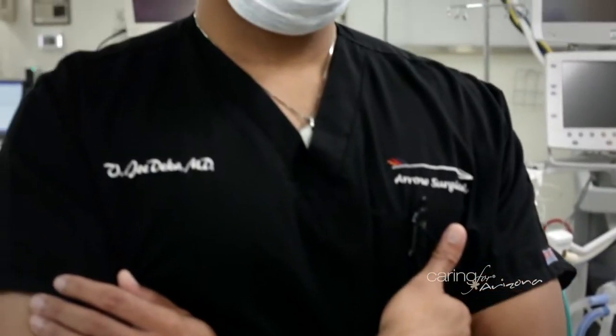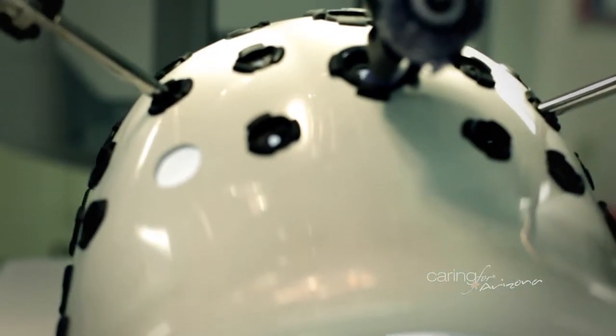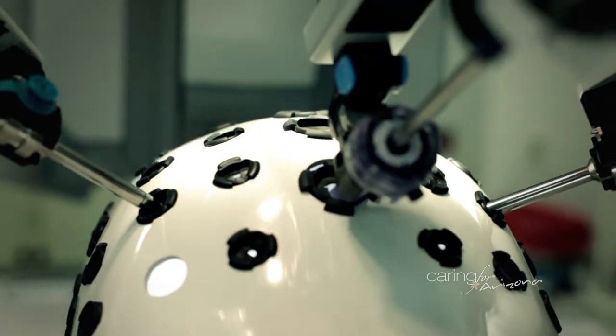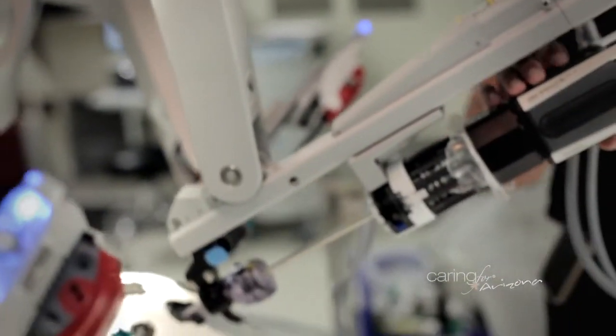The reason people recover a little faster from laparoscopic or robotic surgery is the incisions are smaller, so they might have less pain. They can get back to doing their normal day-to-day things a little quicker. Not every surgeon feels comfortable with robotic or even laparoscopic surgery, so patients should always seek a second opinion. There might be more than one way to do their surgery that may result in a better outcome for them. They just need to be informed and speak with their surgeon, speak with their primary care doc, and if they need to, seek a second opinion. That's never a bad thing.